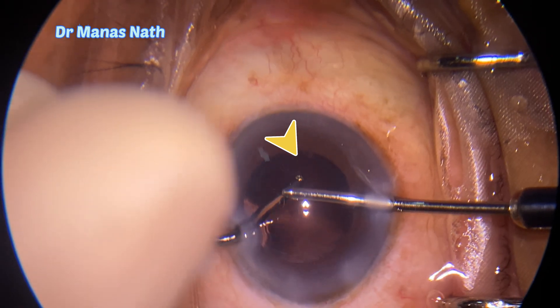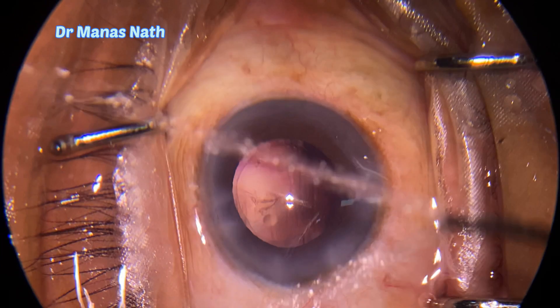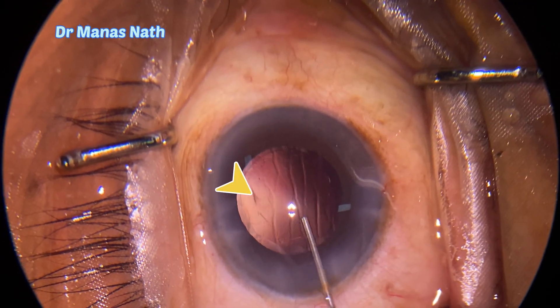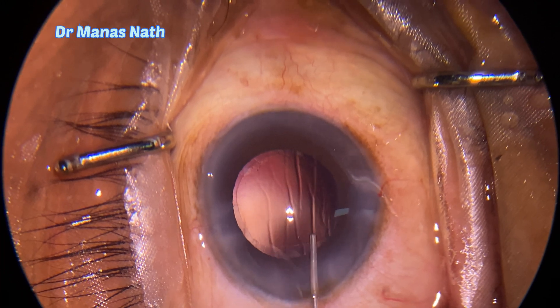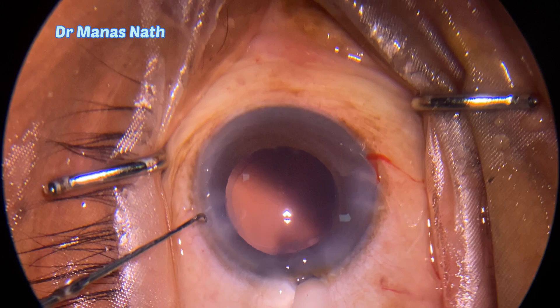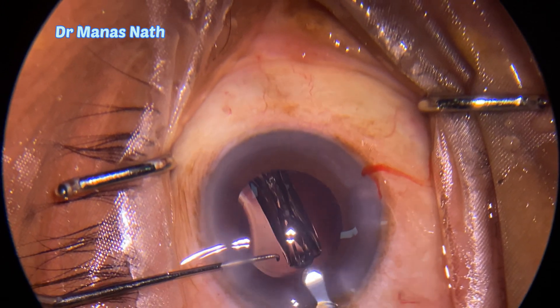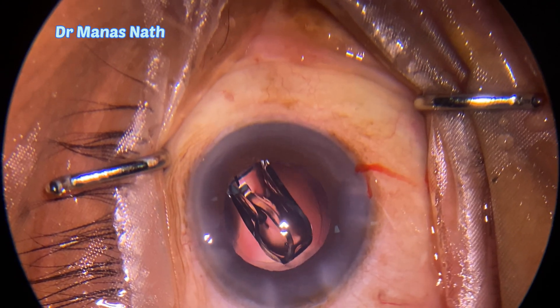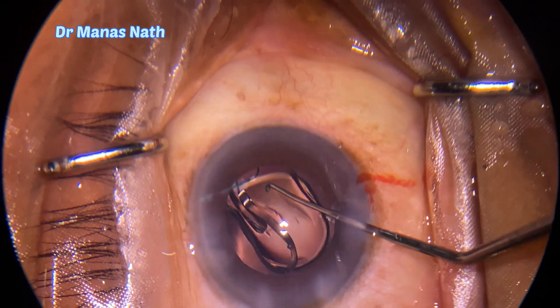A few threads of cortex were there on the posterior capsule; they are also being removed. The remaining cortex is removed with the help of a hydrojet, chamber formed with viscoelastics, and a foldable single-piece IOL is placed within the capsular bag. You can see the slow unfolding of the IOL.